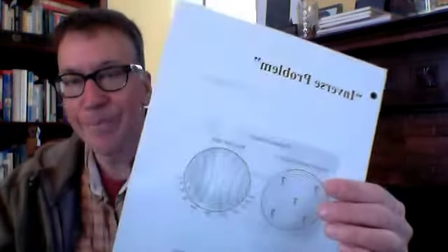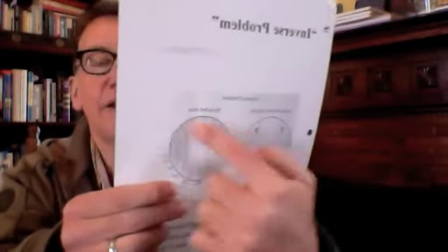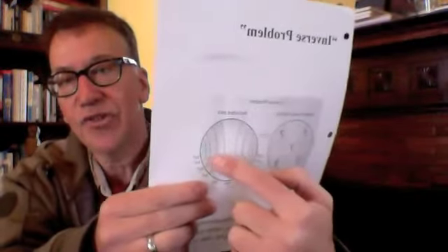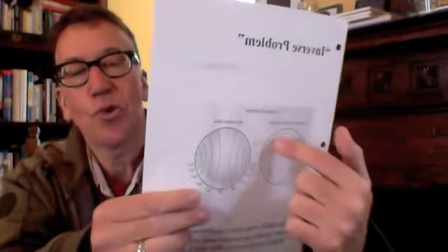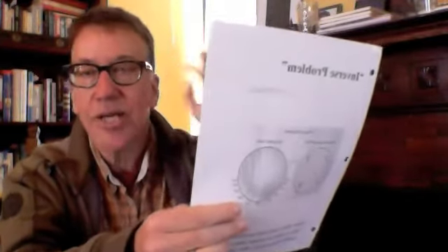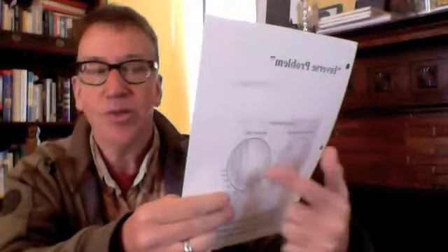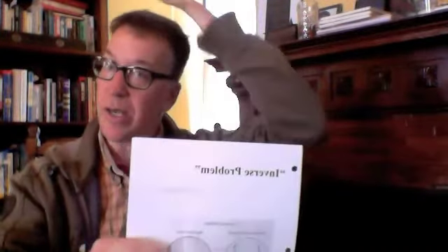And part of that problem is because of something called the inverse problem. If you are recording a certain set of data, like electrical data from the surface of the scalp, it turns out that you could posit multiple generator sources, like activity sources within the brain, that would generate the same pattern. So to go back and determine precisely which regions of the brain are giving rise to the particular tracings that you're seeing on the scalp is a difficult problem. It's called the inverse problem.